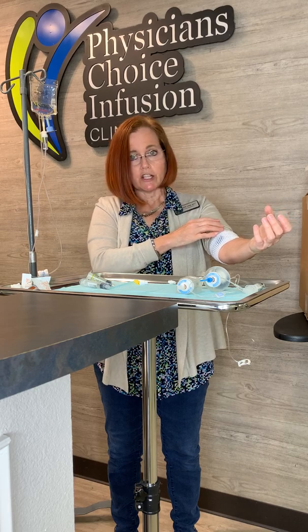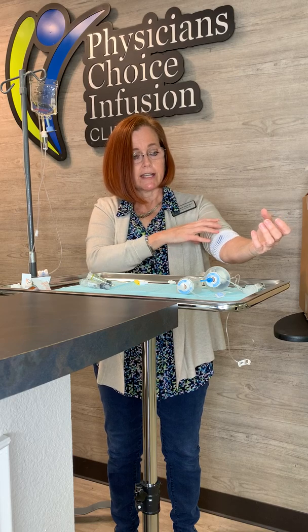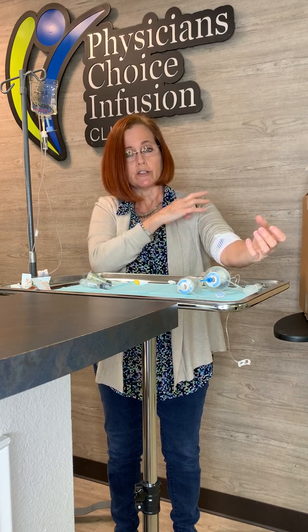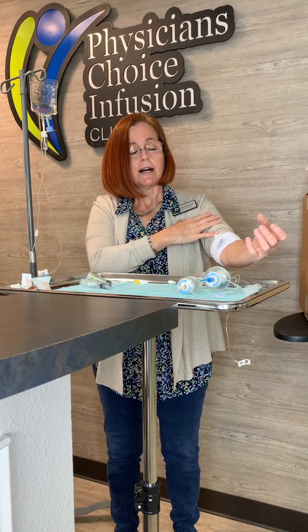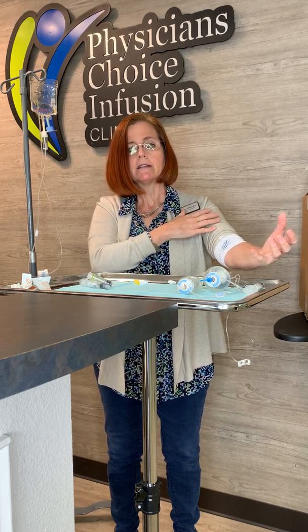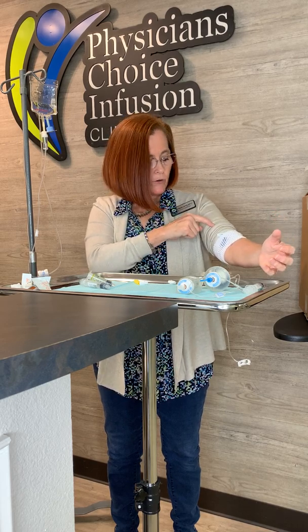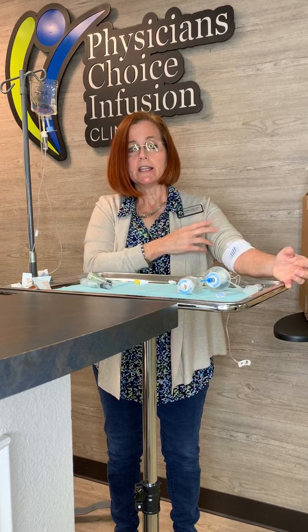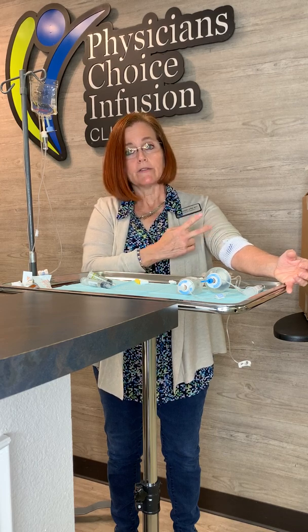If at any time there is drainage, pus, redness, or swelling around the insertion site, or swelling in your arm, neck, and face — that is an ER visit. If you have significant pain, call your provider and they might have you go to the ER. If you have a red streak going up your arm, go to the ER. If the catheter is coming out or gets cut, you have to go to the ER.